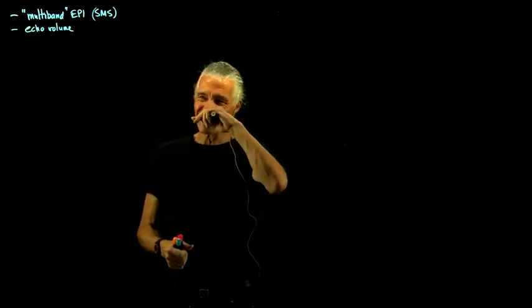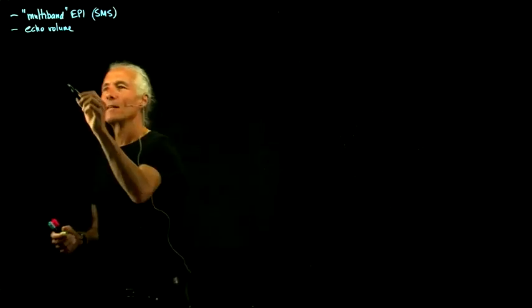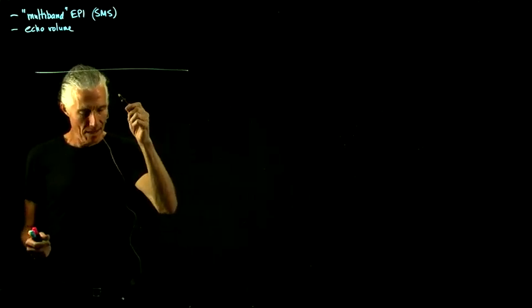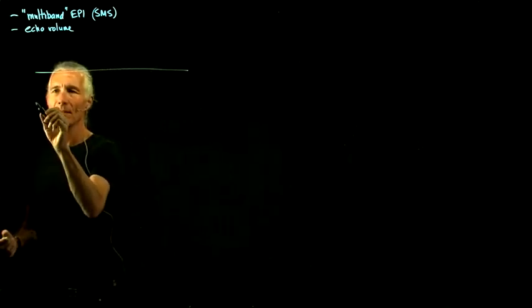And the pulse sequence itself is not very difficult to understand. It looks pretty much like a regular EPI scan, which is what we went over last time.